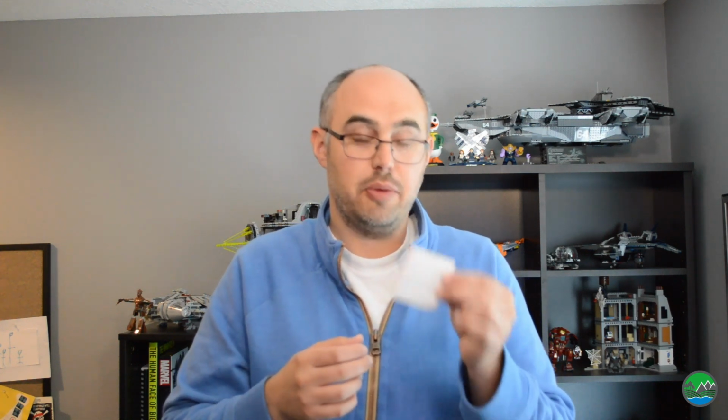And then it also comes with these butterfly closures. These are kind of like stitches, but they're not stitches. They're not staples, they're not stitches, but they are meant to try and keep deeper cuts closed to help with the clotting process and to reduce the bleeding.